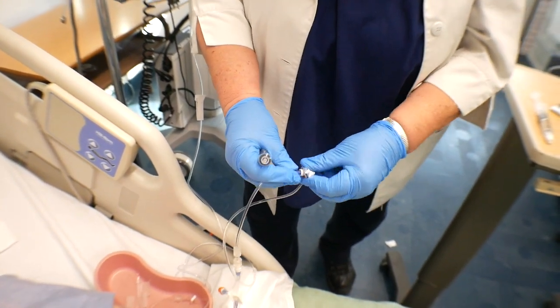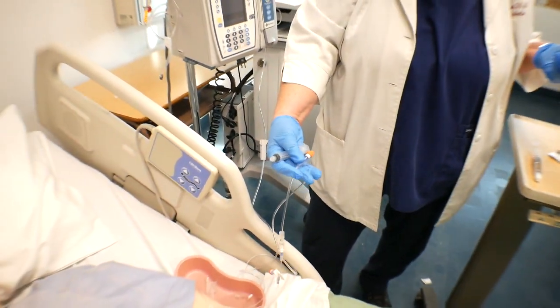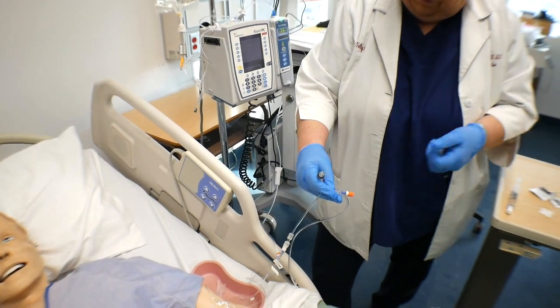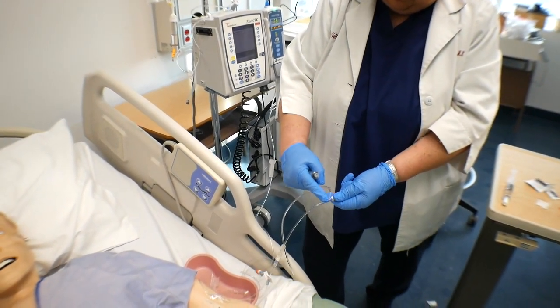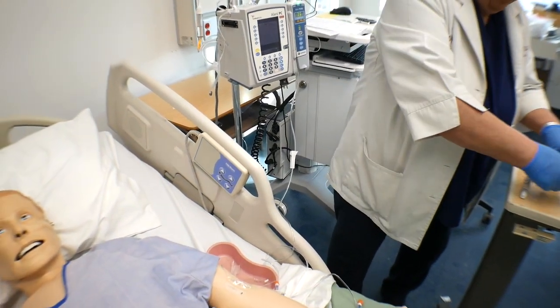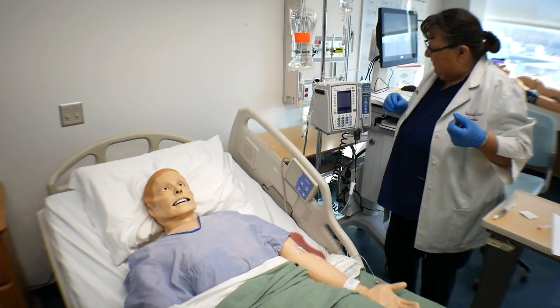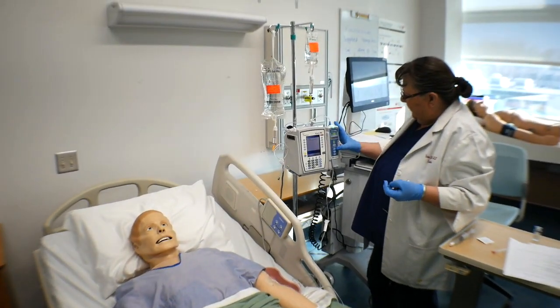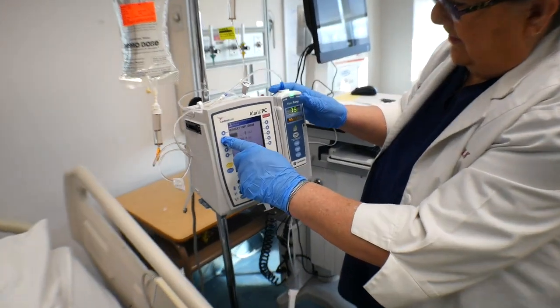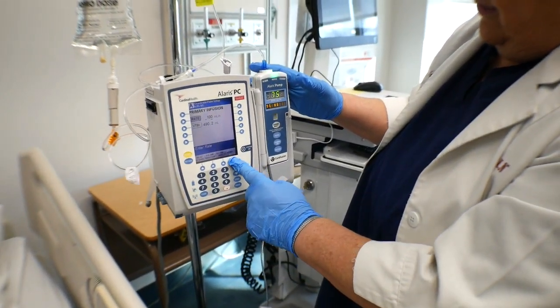I can let it run for a minute or so. Now I could also flush this with saline if I thought there was a little bit residual in this, but these are pretty flush to the tubing, so it should have gone in. So I'll clean up all of my supplies, and then I need to come back and change this back. It was running at 100, so I need to change it back to 100 and then start.